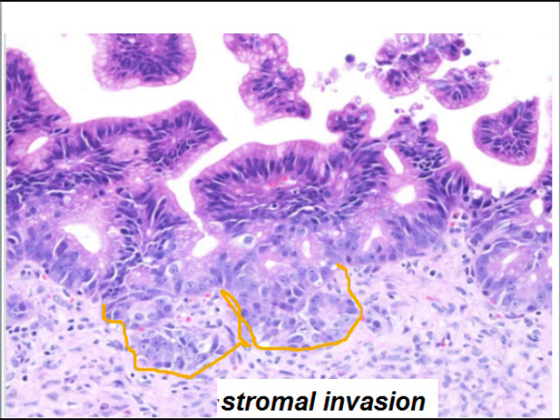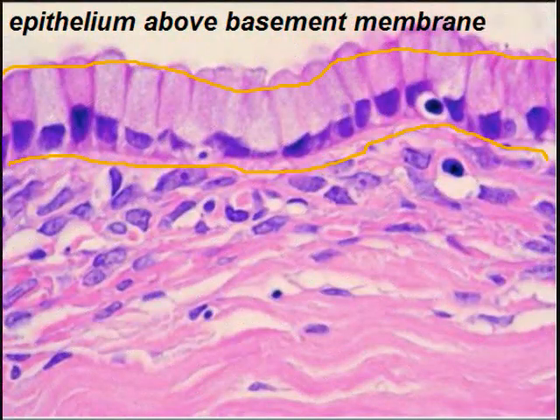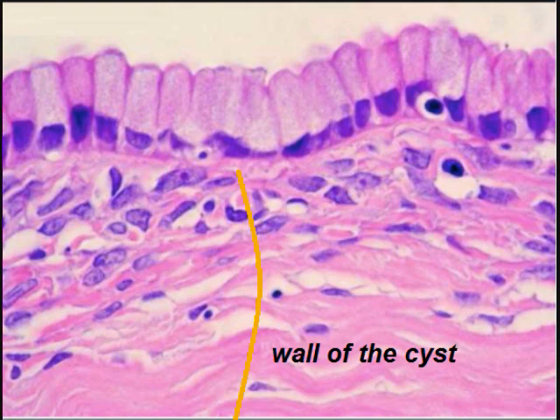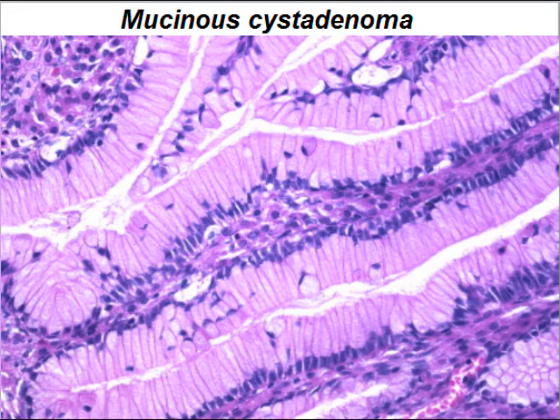Here you can see the stroma is invaded by malignant tumor. For comparison, this is benign mucinous epithelium with the fibrous wall of the cyst. You can appreciate the mucin-filled apical structures and nicely placed uniform nuclei at the basal level of the cells.